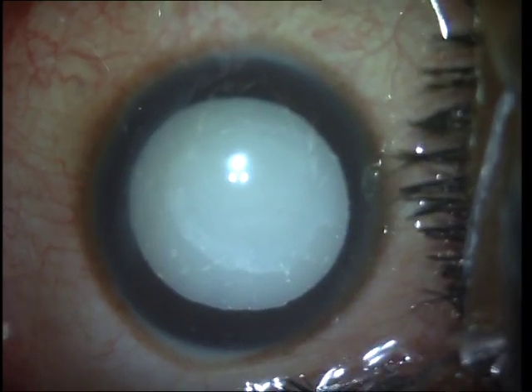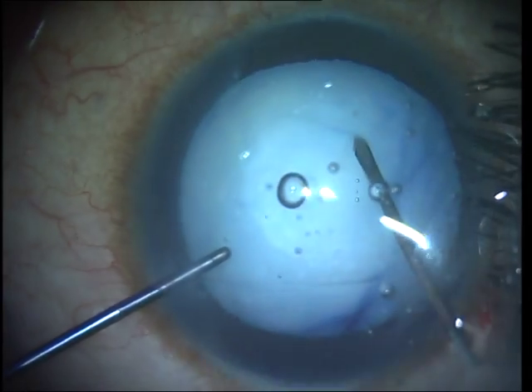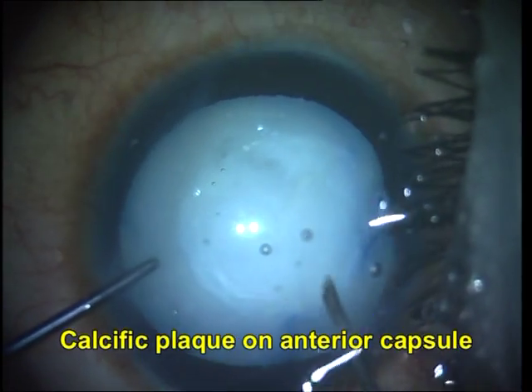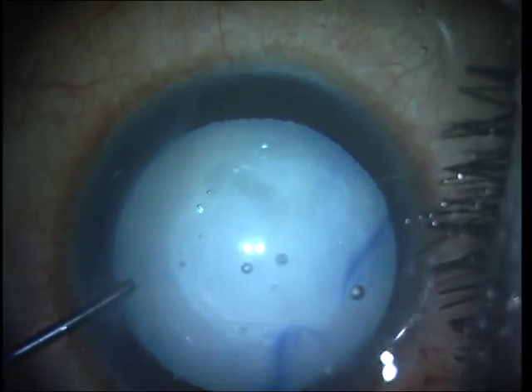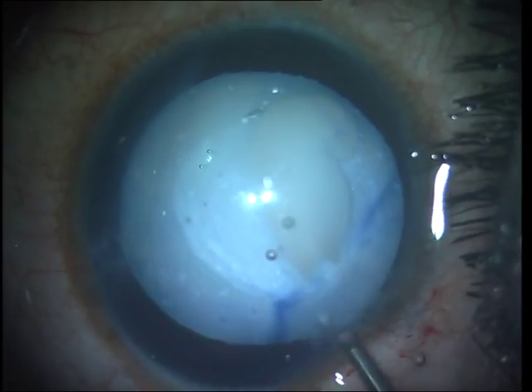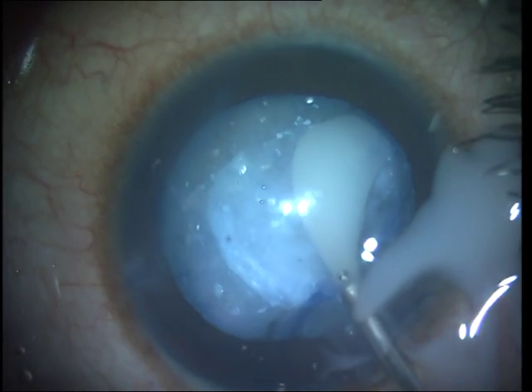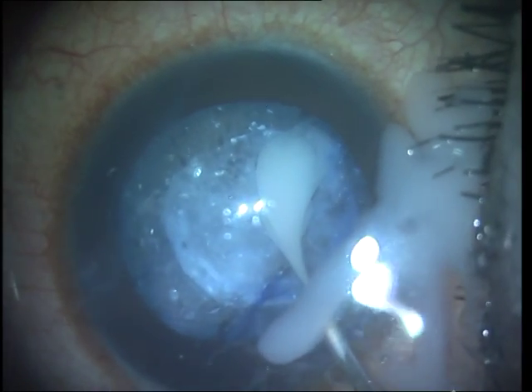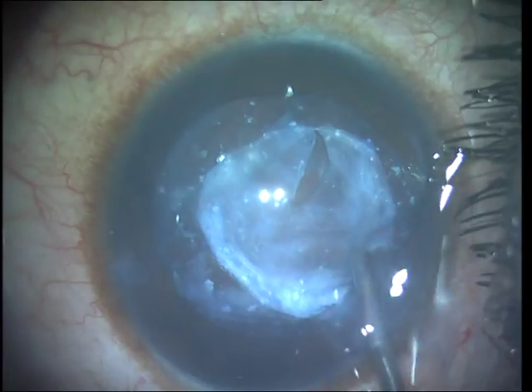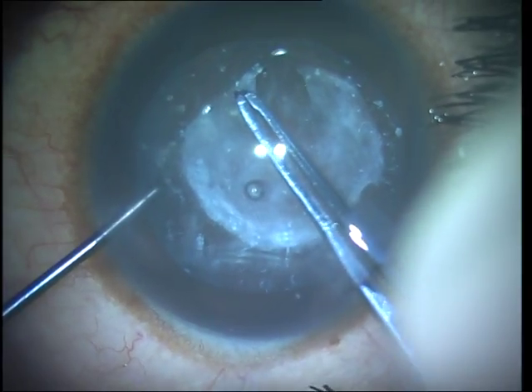The next case is another interesting one — a membranous white cataract. These cataracts can occur either congenitally or post-trauma, and there is either partial or complete resorption of the cortex with a flattened membranous capsule generally seen. I am trying to make the initial nick on the anterior capsule, however there is a calcified plaque over the anterior capsule, so I am forced to take a Vannas scissor and cut that plaque to get an initial opening. As soon as I do that, some liquefied material comes out, and as I remove it the white color of the cataract clears up spontaneously — the capsular bag contents are almost completely evacuated.